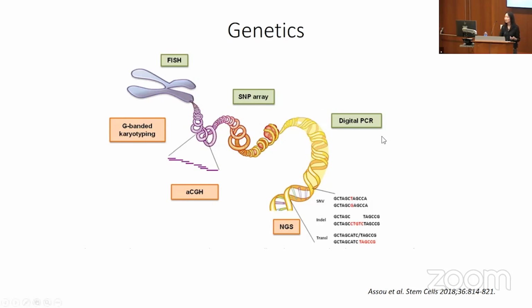Versus in the green here are assays in molecular, which are probing a specific abnormality. So you have to have a question in mind, just like flow. You have to say, oh, I want to look for how many blasts there are. I want you to look for B cell clones. So for FISH, it's like saying, I want you to look for a deletion in 5q. So then there will be probes to that. Okay, so these are all looking for specific abnormalities. That is helpful in certain instances. And these are looking for kind of overall, let's see what you find.